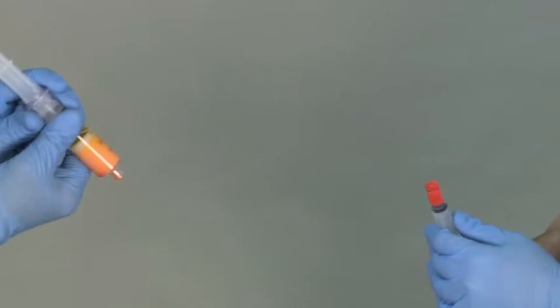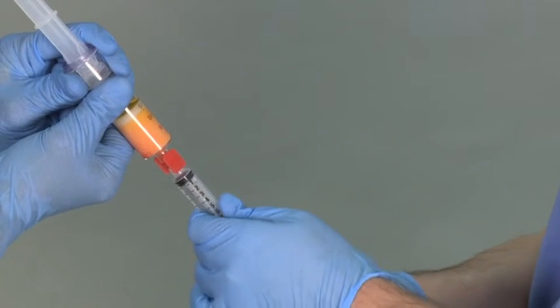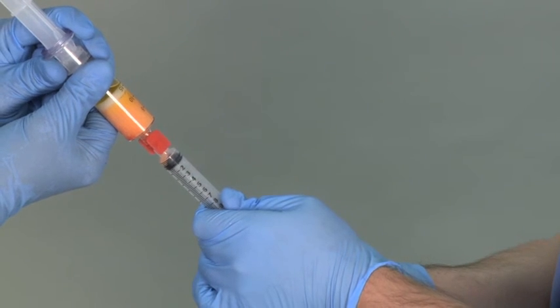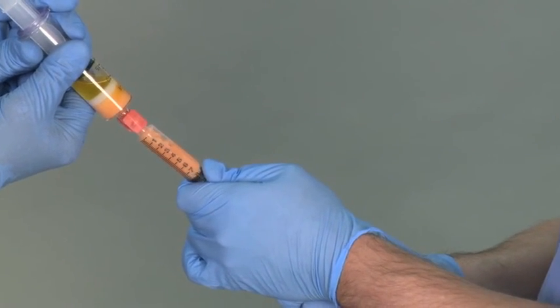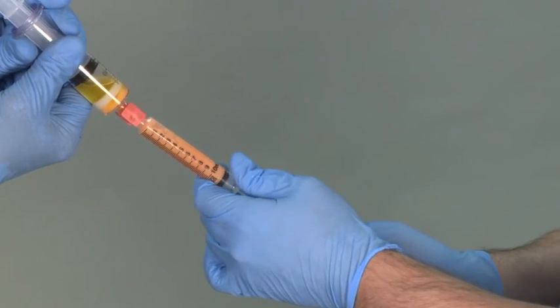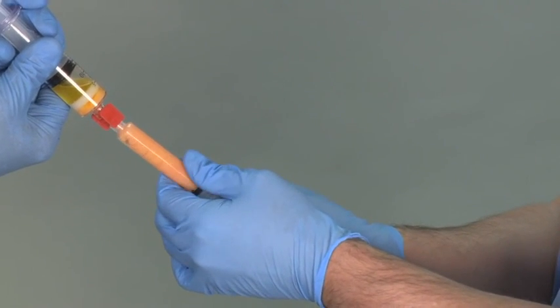Within the sterile field, attach a female-to-female connector to a sterile treatment syringe. While maintaining the treatment syringe's position in the sterile field, attach the Adiprep process disposable via the female-to-female connector. From the sterile field, draw the concentrated adipose tissue into the treatment syringe. Remove the treatment syringe from the female-to-female connector, leaving it behind with the processing disposable outside the sterile field. The concentrated adipose tissue is now ready for clinical use.